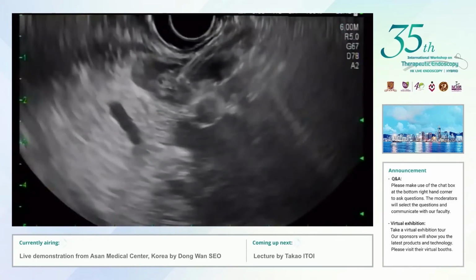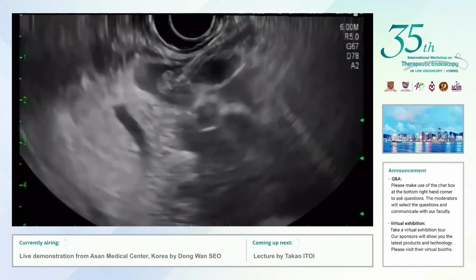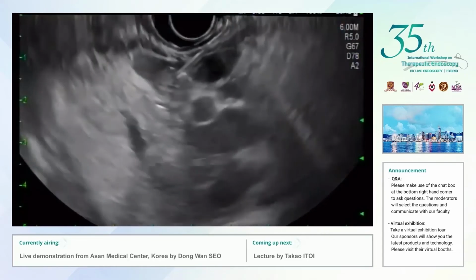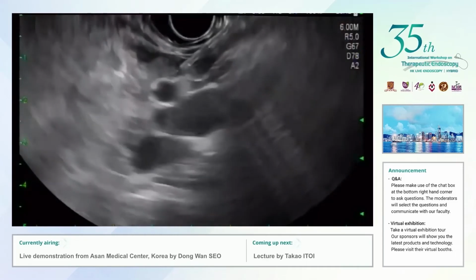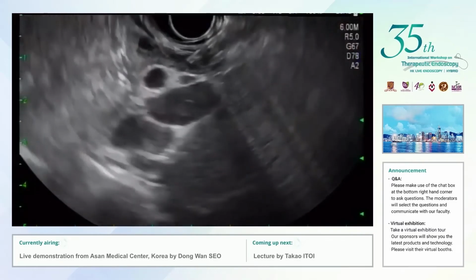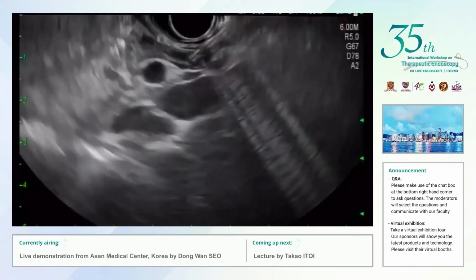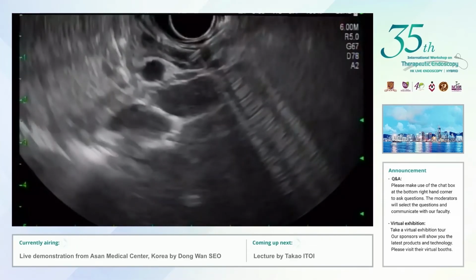Then when we get the result, we can multiply the result by a factor of 10. As you see here, there is some sludge-like mucinous material. Actually, it blocks further aspiration of cystic fluid, but I think we already have some amount of fluid, so we will stop the procedure here, and we will dilute this fluid and send it for analysis.